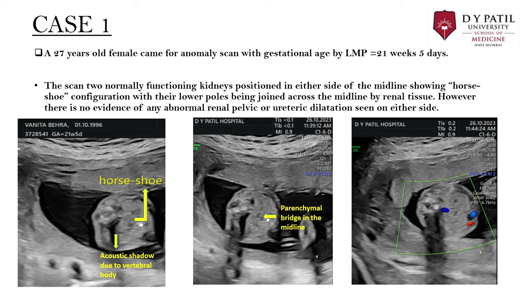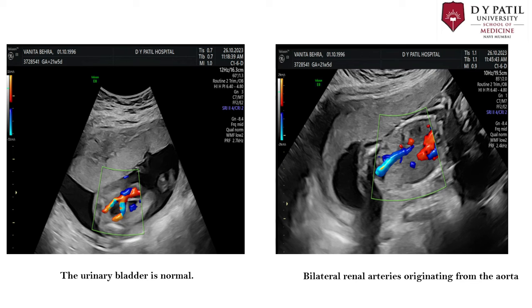In the image, we can see two isoechoic structures joining in the midline, along with the vertebral shadow. The joining is seen just anterior to the vertebral body. In the second image, there is a parenchymal bridge visible in the midline. The urinary bladder appears normal, and umbilical vessels are visible on either side. On sagittal view, renal vessels are seen arising from the aorta on either side, indicating each kidney receives individual blood supply.